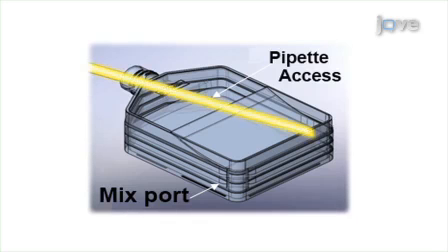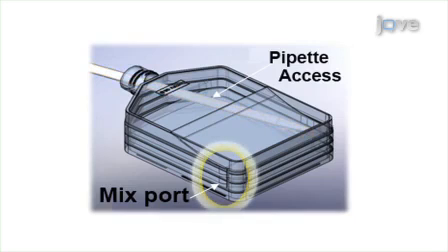Pipette access facilitates addition and removal of cells and reagents into and out of the vessel. The presence of the mix port allows for rapid in-vessel mixing and equalization of media across all layers of the multi-flask.